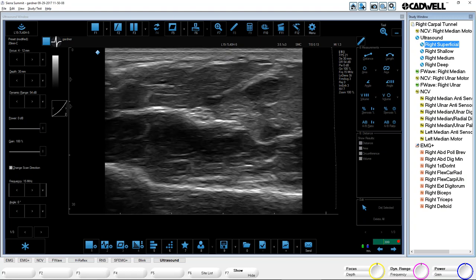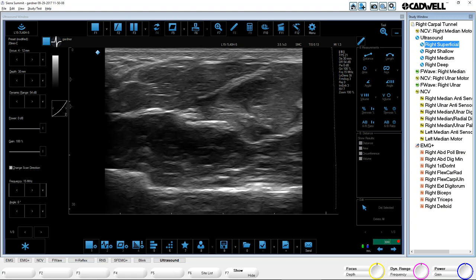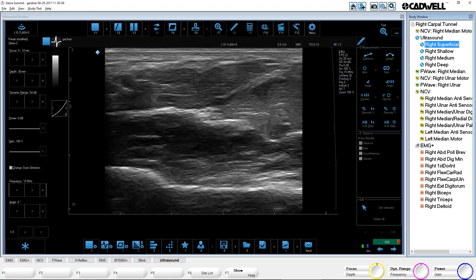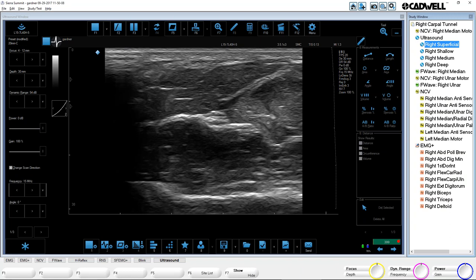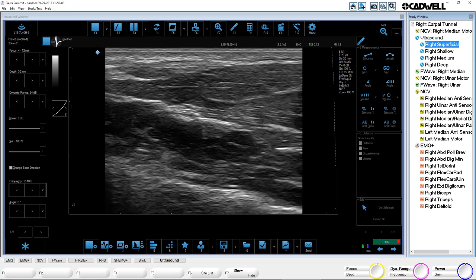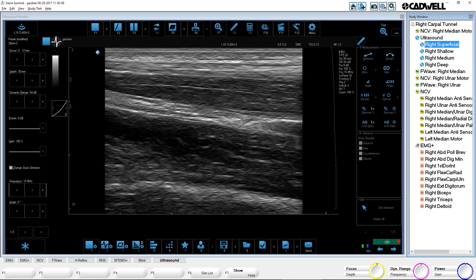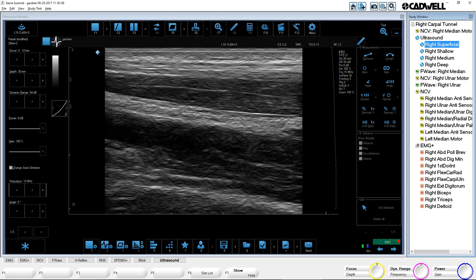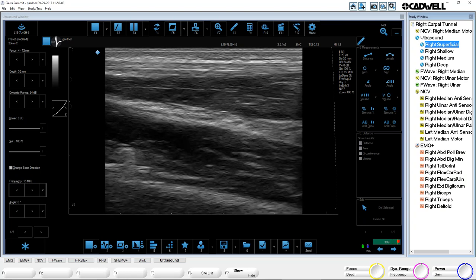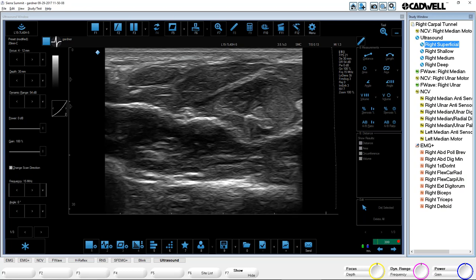The other thing they'll want to do is rotate the probe so they can see the nerve in long axis. Right now I'm seeing a cross-section because I have it across my arm. If I go parallel to my arm with the probe — keeping that nerve right in the center of the screen as I rotate — now you can see a nice long axis. That's the long axis of the nerve — you can see the fascicules in there and the sheath on either side. I can spin the probe back and now I'm seeing a cross-section of that nerve.